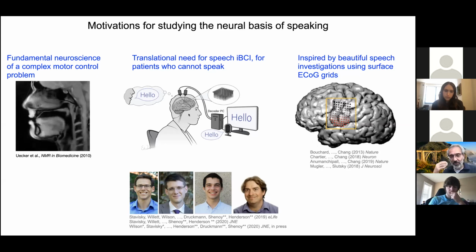But, welcome to the wild and woolly world where different functions are really where they shouldn't be and back and forth. The signals are undoubtedly weaker than if we properly targeted them. And that's what we're going to try to do with our next participant. So they would be instructed to say words, we would record that auditory track, record the neural activity, and then we'd see how far we go.